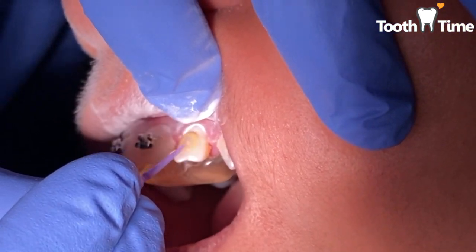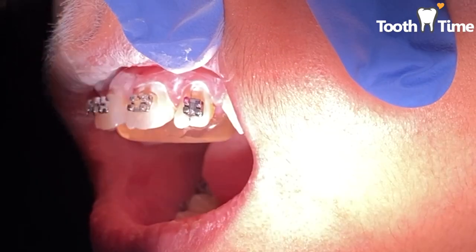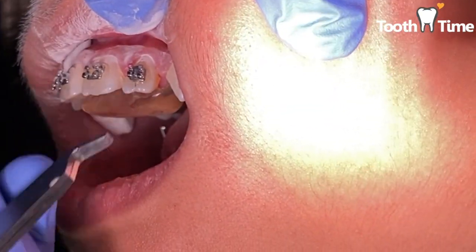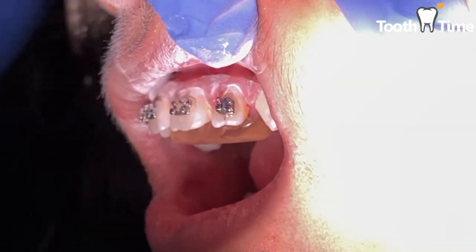When brackets are repositioned and wire placement is placed back on, sometimes the patient feels a little bit sore because now the brackets are angulated at a different angle and it makes the wire a little bit more stiff.